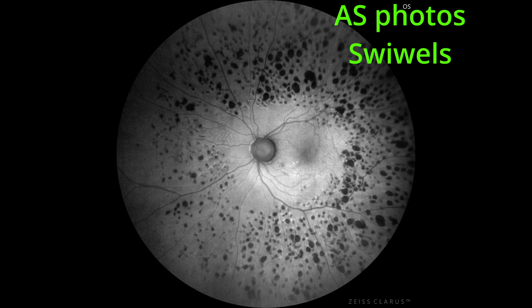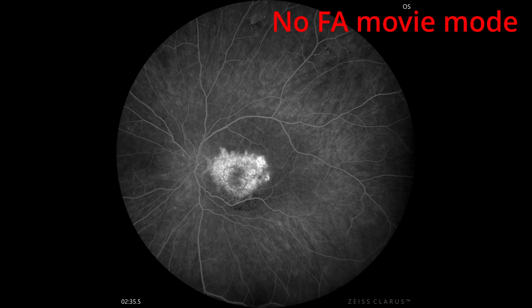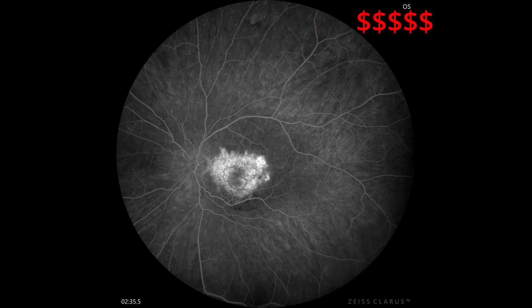What are the Clarus downsides? You need a skilled technician to get those images. The FA doesn't have a movie mode, so you can lose the loading phase and important early frames. And perhaps most importantly, it's pretty expensive. If you want to review images on a computer, you need separate software. But when it comes to beauty, quality, and resolution, this is probably the best fundus camera available on the market.